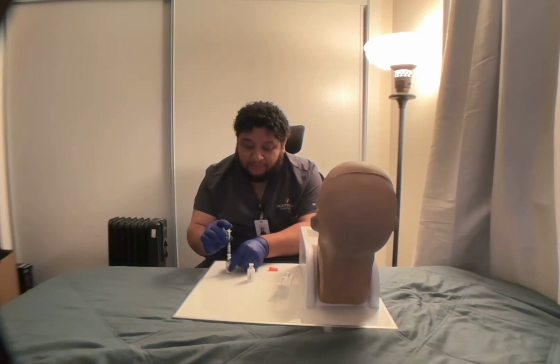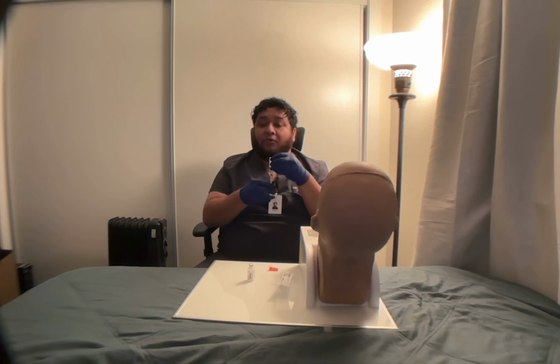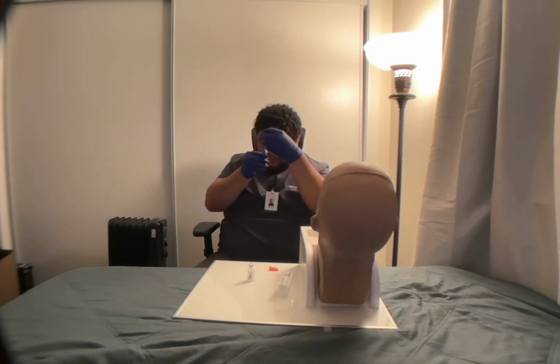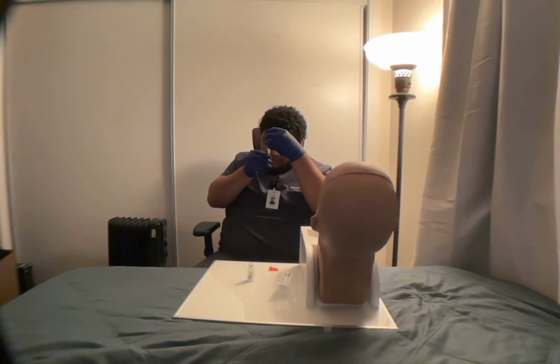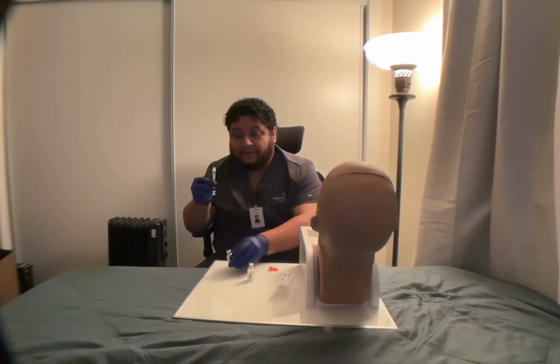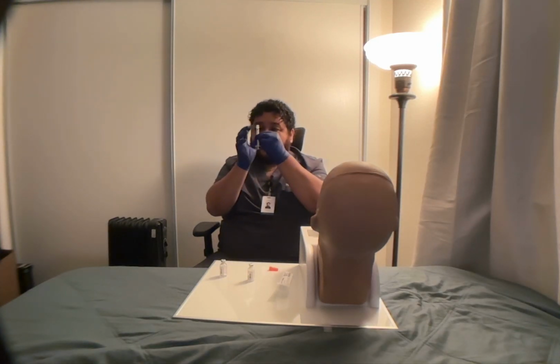Push the plunger, invert the vial, and draw 4 units of regular insulin. Okay, that's 4 units of regular insulin. I'm going to tap to remove any air bubbles.